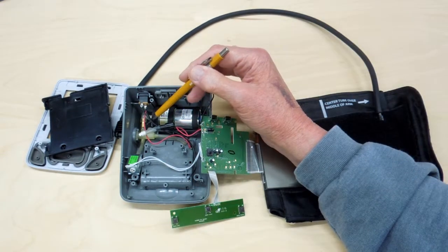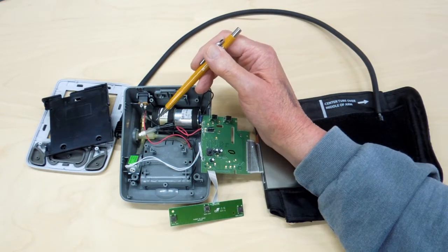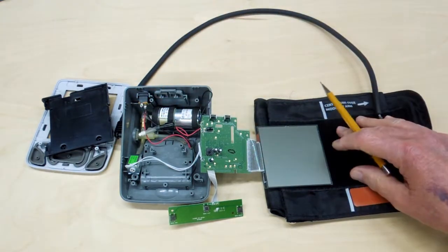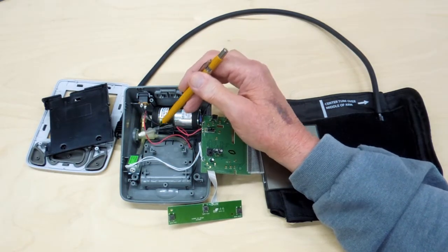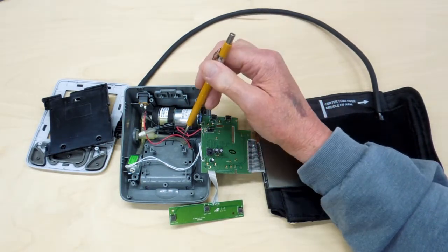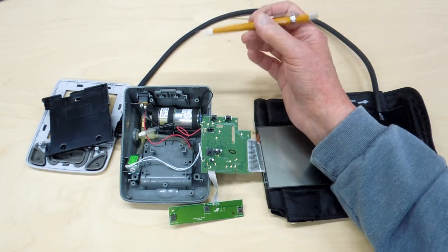Air from the pump comes into this junction block. This little brass piece here appears to be an orifice. Air goes from the junction block through this hose to the pressure cuff, and the line comes over to this mechanism and then comes back to the circuit board. I'm going to reconnect this to the circuit board, plug it in, and see if I can figure out what does what.